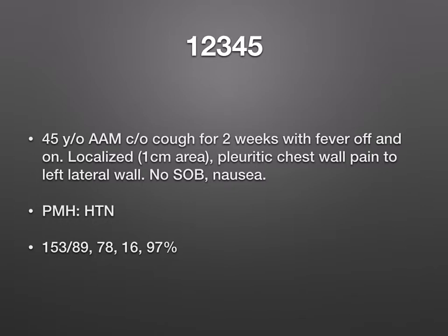All right, next case, and this is the one that I made up, and I made it up because I didn't have a case handy to demonstrate. So this is a patient that I did see the other day in the emergency department. I just had to make the EKG up. So this is a 45-year-old African-American male. He is complaining of cough for 2 weeks. He's had a fever off and on.